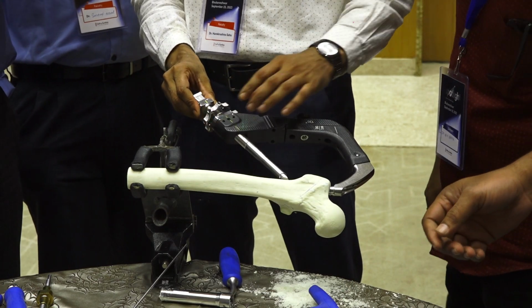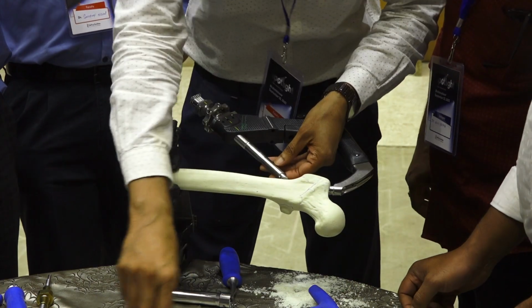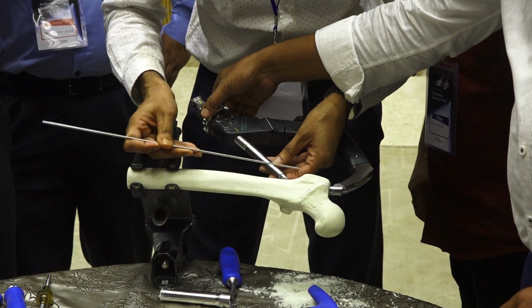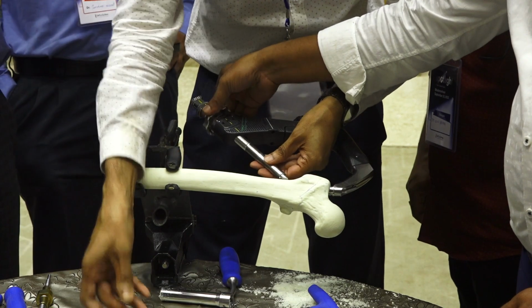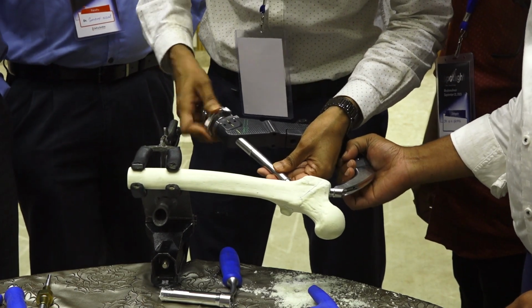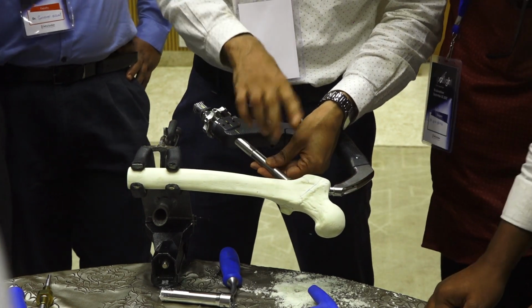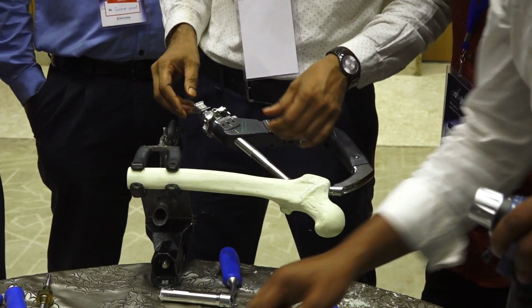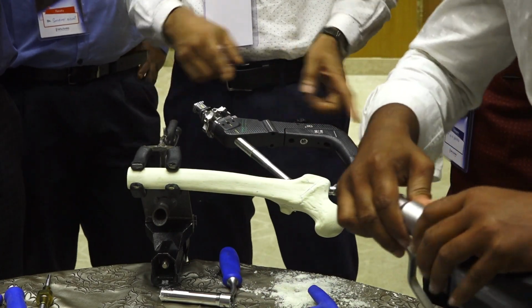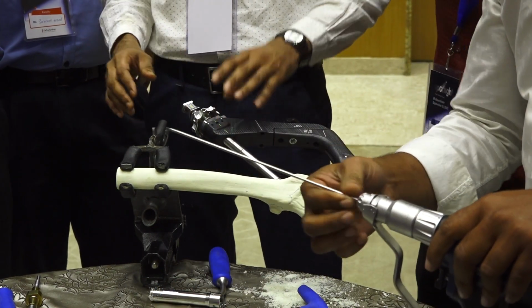Then you have to match this and after checking in C-arm this area should touch the cortex, this little bit should touch the lateral cortex. Under C-arm then the jig is perfect and there will be no mismatch. After that you take the guide pin. Before that you can check through this area also whether the handle is okay or not.